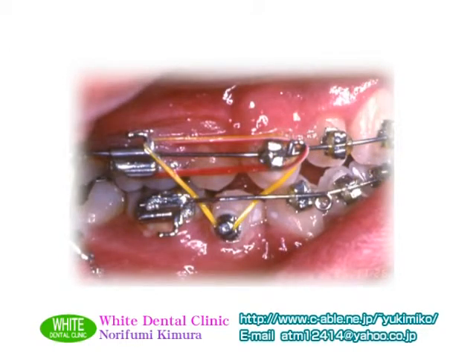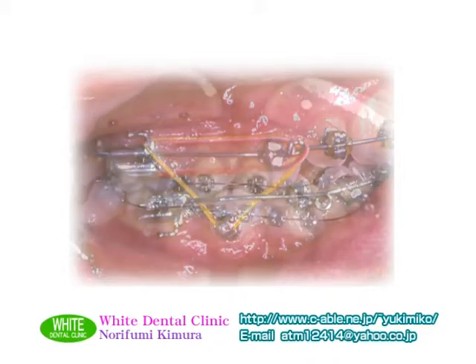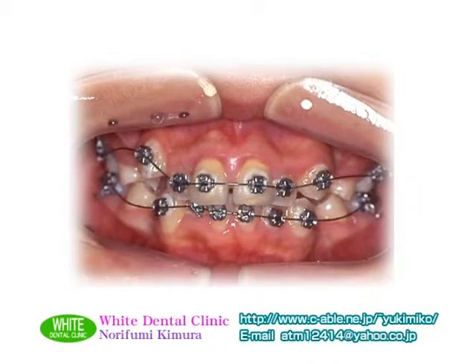I have provided orthodontic treatment with a tip edge technique. However, the slide type bracket provides significant merits with the edgewise technique. The technique is described here with respective figures.